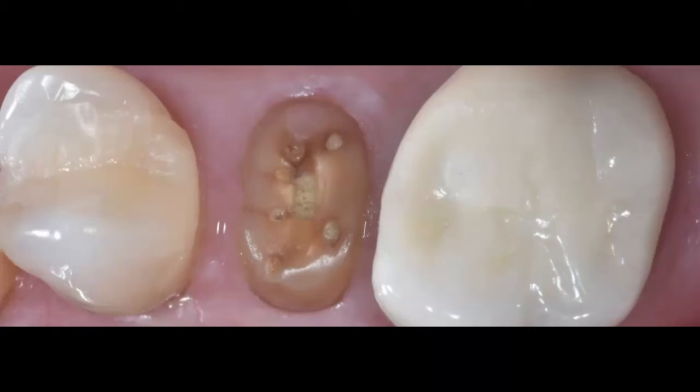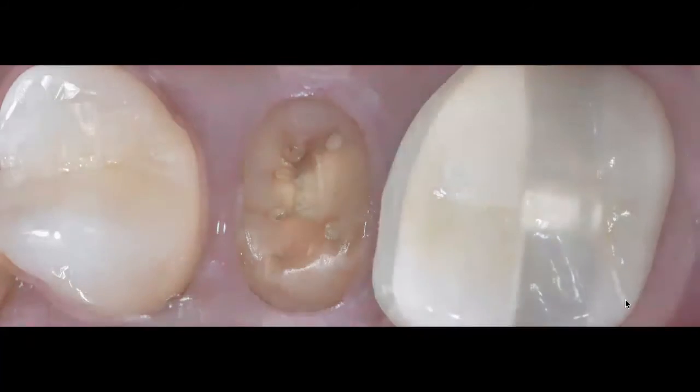Ideally it would have been to have more tooth structure and the tooth vital, but you don't have a lot of tooth structure here, and the tooth has lost vitality. So the question is, is there any way from a biomimetic standpoint that I can restore this tooth? And the answer to that question is 100% yes.